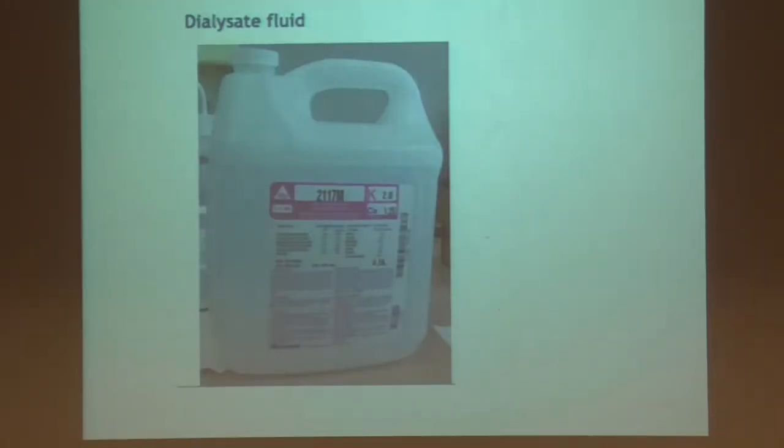Just want to make a note on dialysis fluid, because this is an introduction to dialysis and CRRT. In this hospital we use SLED, so I'll talk about that in more detail than the other methods, because that's what we see every day. If we ever switch machines later, we can talk about that another day. But most of our baths, if you look at the bottom of the machine, you're going to see two jugs like this. One's the bicarbonate and one's all the electrolytes.